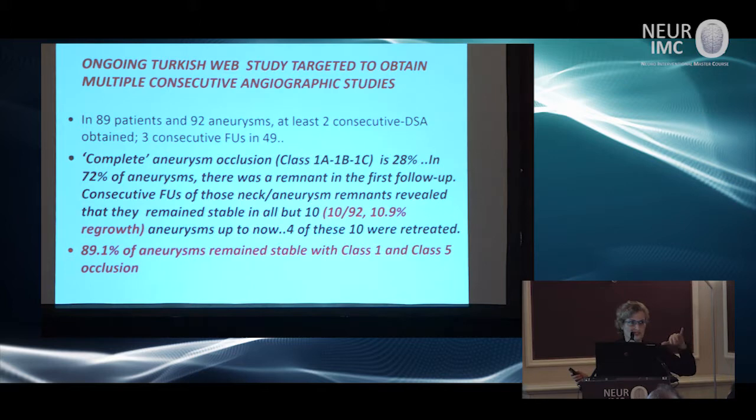So don't get the impression, because I showed you good examples at the beginning, that it is a 90% result. It was in the first follow-up only 28%. In 70 or more, 72% of the aneurysms, there was some kind of remnant in the first follow-up.